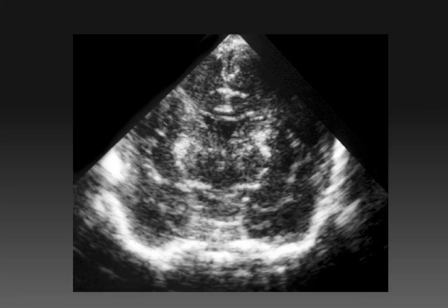Here is another infant who has brightly echogenic symmetric lesions in the basal ganglia. This child is now four weeks post hypoxic ischemic injury, and these lesions gradually appeared over the last week. At autopsy, when this child died two days later, these areas represented focal gliosis. We do not generally see gliosis in premature infants; this is a phenomenon that is only seen in term or near-term infants.